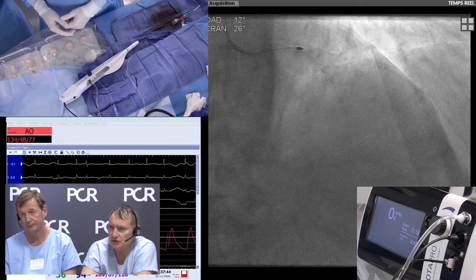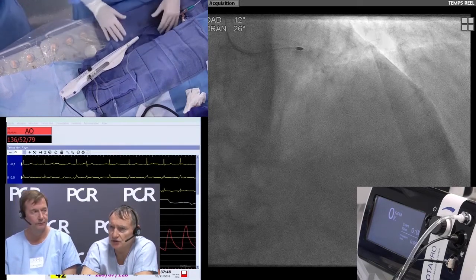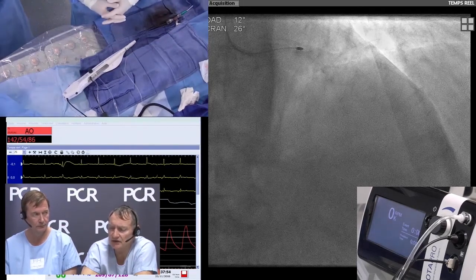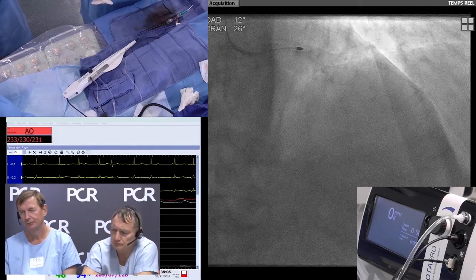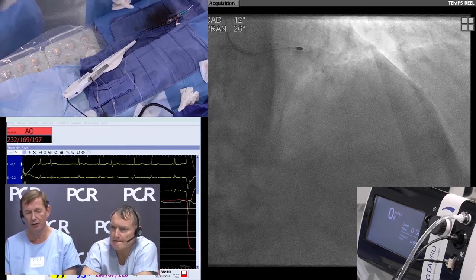I will show you how to perform a Dynaglide after, if you're okay. Maybe. Okay, just another question. If you have a bradyarrhythmia, do you use a treatment like aminophylline or not? No, never. We sometimes wait. We use atropine a bit if needed, but really just atropine, not aminophylline. Okay. Yes. Okay, let's have a look at the technique for getting the burr out.